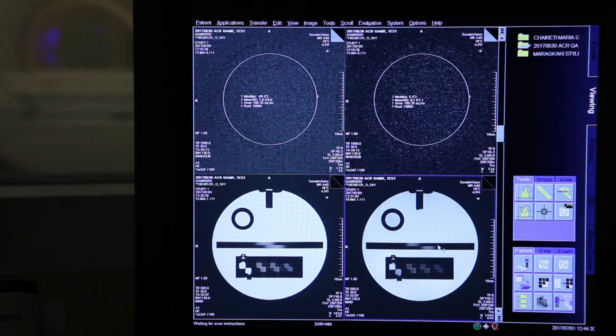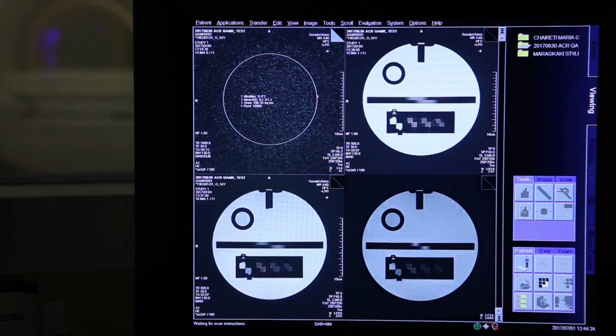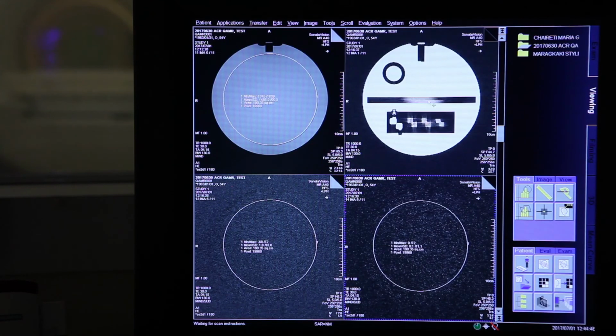Even smaller. Okay. And the 1mm slice. You're able to measure it. Yes. We don't have the perfect localization of the phantom at this level, but you have to take into account the shifts in 3 dimensions, right? You should have the slice, the upper part, being the same as the lower part. So they should follow this orientation. They should be close.